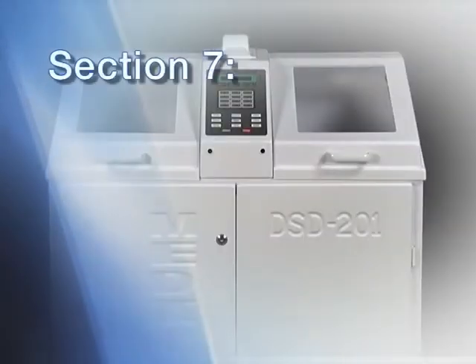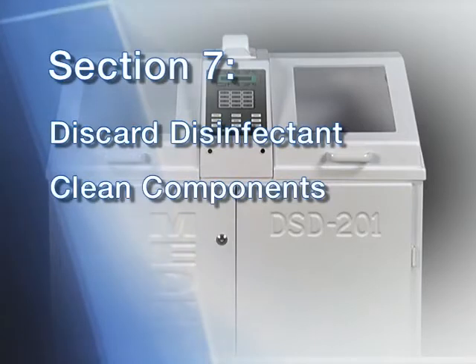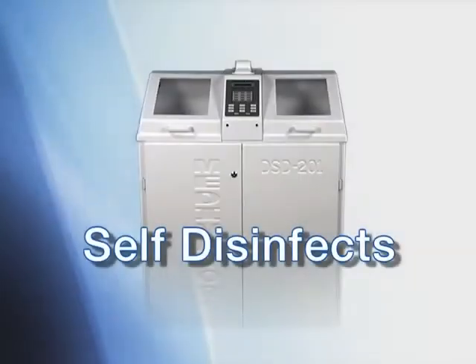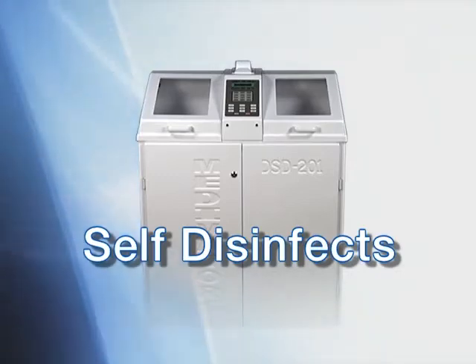In Section 7 we will demonstrate the procedures for dumping the disinfectant, cleaning the disinfectant reservoir, changing the disinfectant filters, and loading new disinfectant into your DSD-201. Loading the disinfectant can be accomplished either with the on-board automated loading system or by pouring disinfectant directly into the basin. One of the unique features of the DSD-201 is that it self-disinfects during each cycle — no additional disinfection procedure is required to maintain your reprocessor. However, periodic filter and disinfectant changes are required.